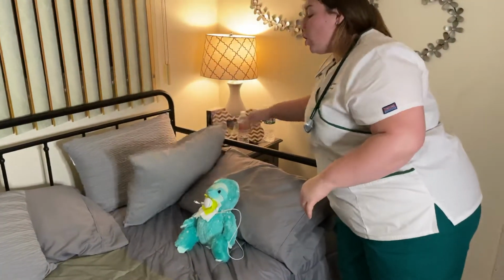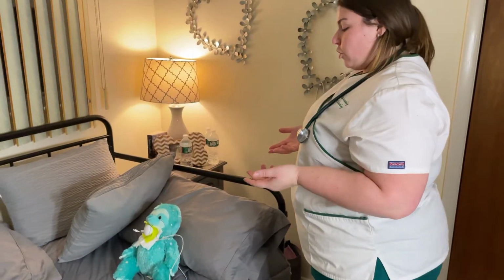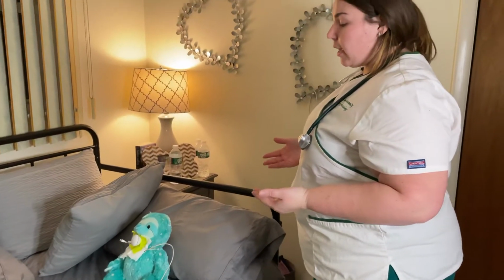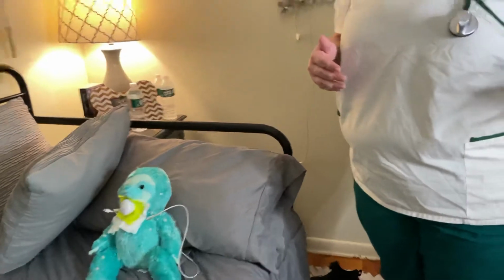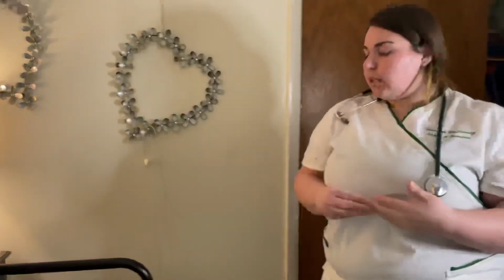position for them. We want to put the side rail back up and make sure, Mrs. Gerban, that there's nothing that I could do for you. Are you comfortable? Do you need anything? The patient is okay. At that point, we will let the patient know that we are going to return and document the trach suction and care that we did. And that is it.